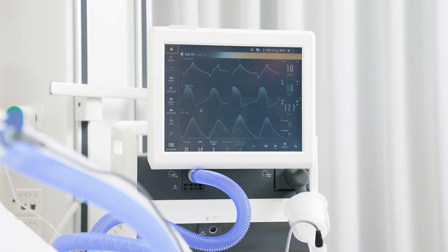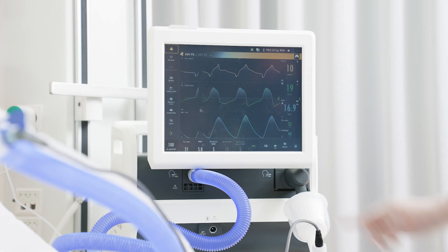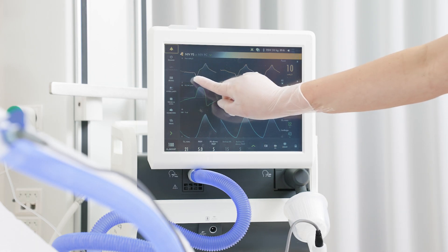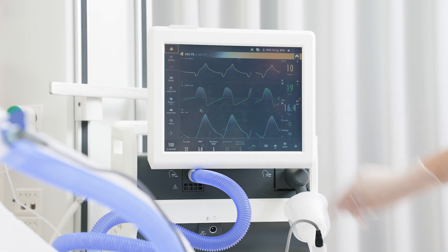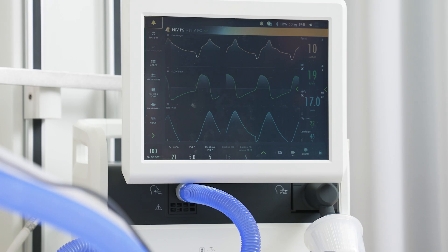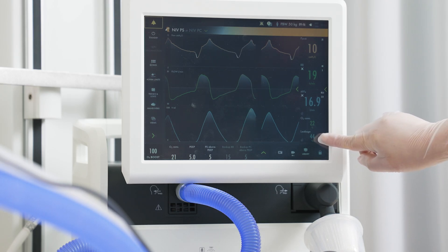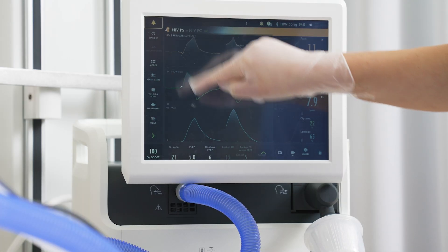The trigger sensitivity is automatically adjusted and compensated for the leak. Trigger criteria are based on flow or pressure. The white indication on the flow or pressure waveforms shows how the breaths are triggered. The leak percentage is shown on the screen — it is an average over the last 30 seconds.